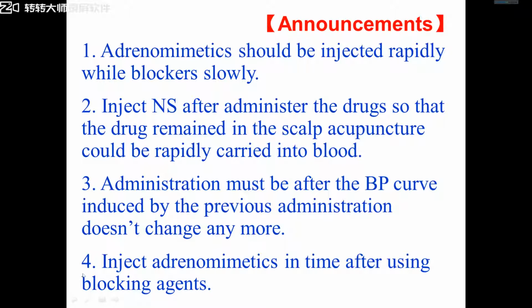The last notice is to inject adrenomimetic drugs in time after using blocking agents. Yes, we inject phentolamine and then wait 3 minutes. We inject adrenomimetics, repeated use. After we inject propranolol, we wait 5 minutes, and we inject adrenomimetic drugs in time.